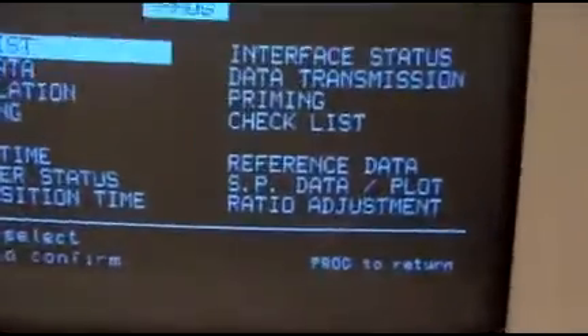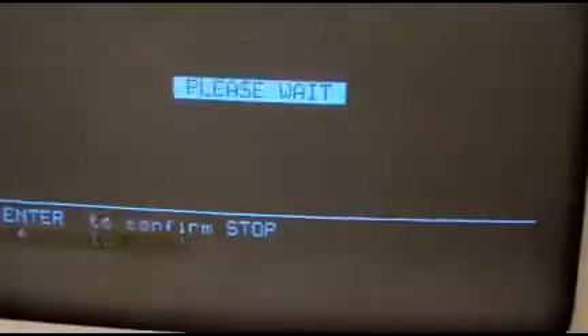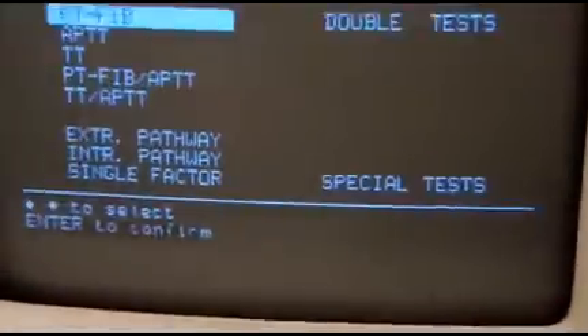So it's several minutes later — I actually turned the system off and turned it back on. I did set the date to the correct time, but it still has me in this 'please wait' mode. I'm not sure what's going on with it; it may be a temperature issue.